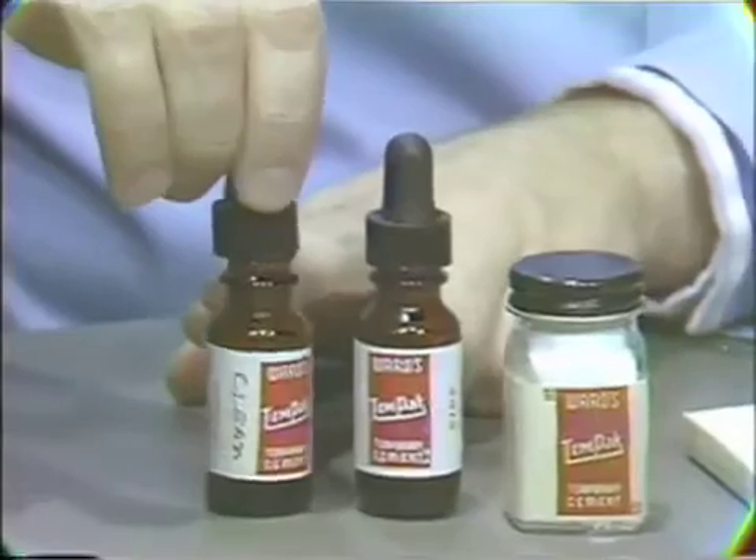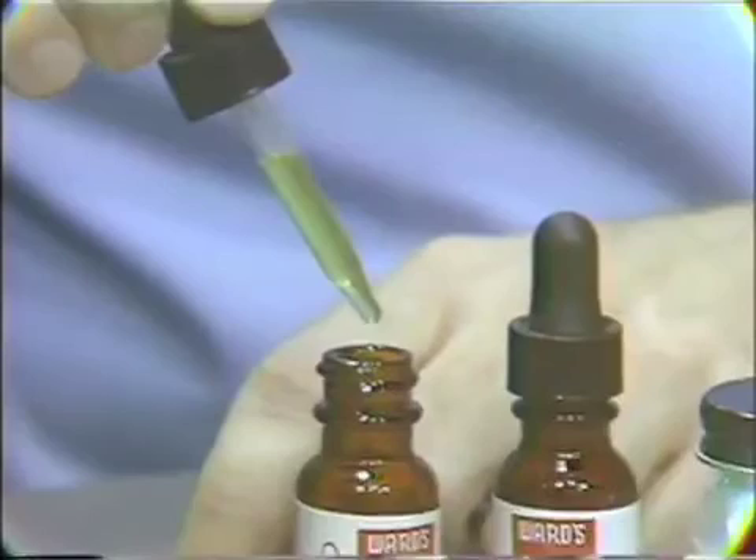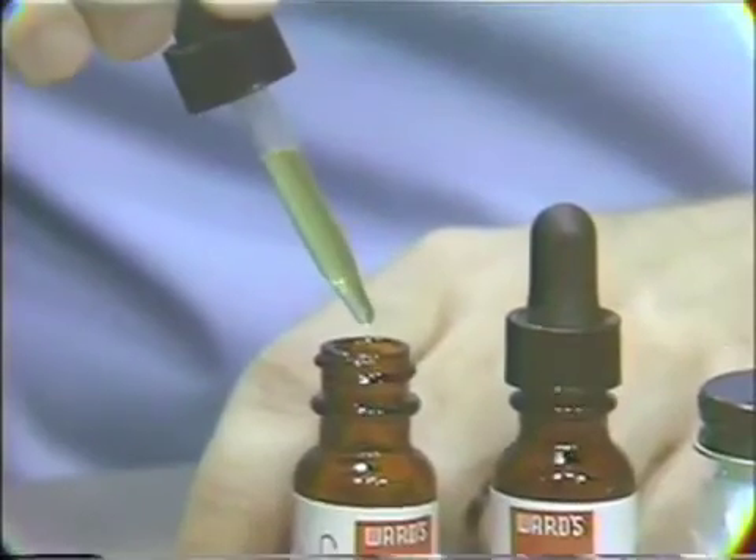On the other hand, in anterior areas where aesthetics are of prime importance, it also comes with an alternative colorless liquid.